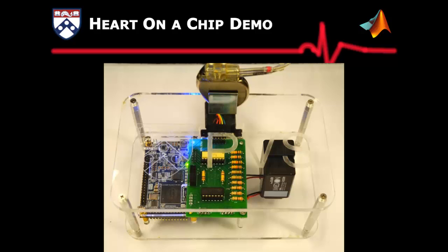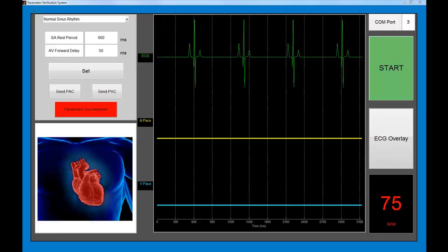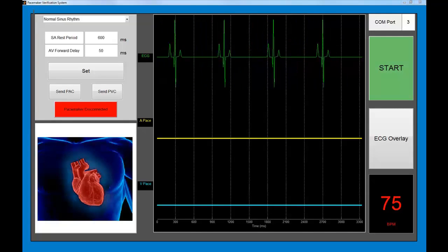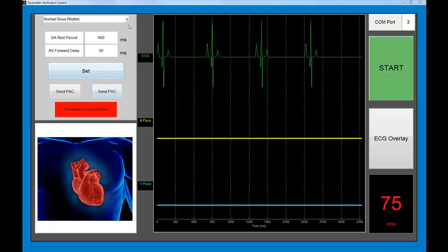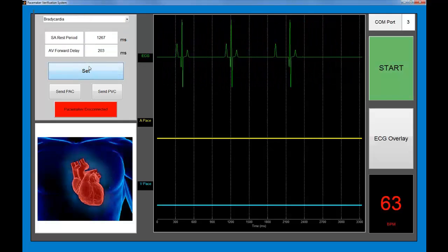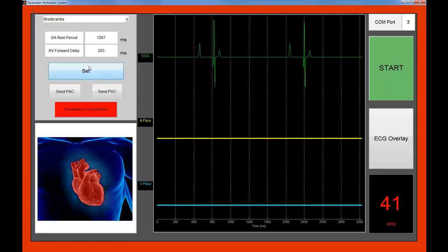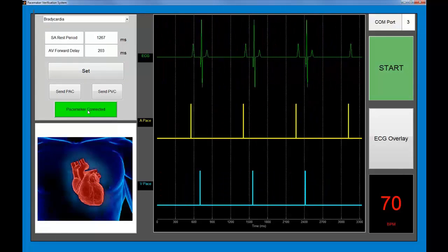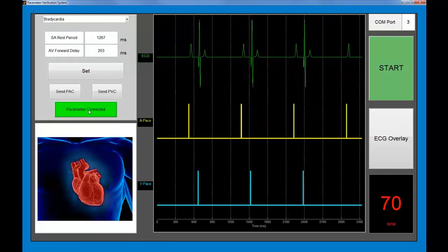Now we demonstrate ELT on the heart-on-a-chip platform with our heart model implementation interacting with a real pacemaker. A user interface is designed to monitor the interaction between the heart model and the pacemaker. Currently, the heart is beating at a healthy 75 beats per minute. We can change the heart condition by selecting a condition from a drop-down menu. During bradycardia, the heart is beating at an unhealthy 41 beats per minute. When the pacemaker is connected, the heart rate is restored to a healthy 70 beats per minute again.